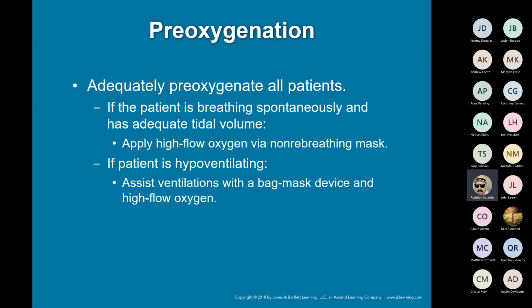But if you've been part of an intubation before, they'll call it bagging the patient up. They have somebody literally pre-oxygenate, get the patient ready. They'll sit there and bag them for a little bit while you're getting your equipment ready. At the point that you are ready, you'll let them know. They will then remove the bag and you'll perform the intubation.